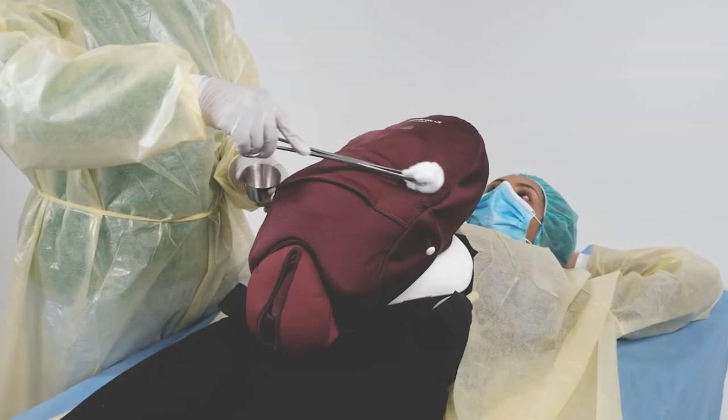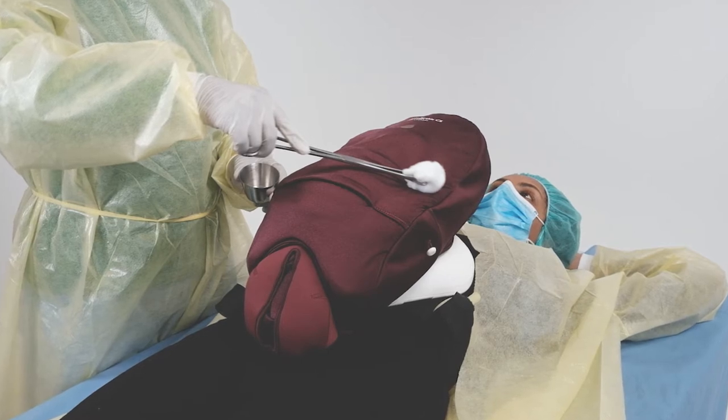This is an instructional video showing how to use Mama Berthi CS to practice preparing a woman for a cesarean section.